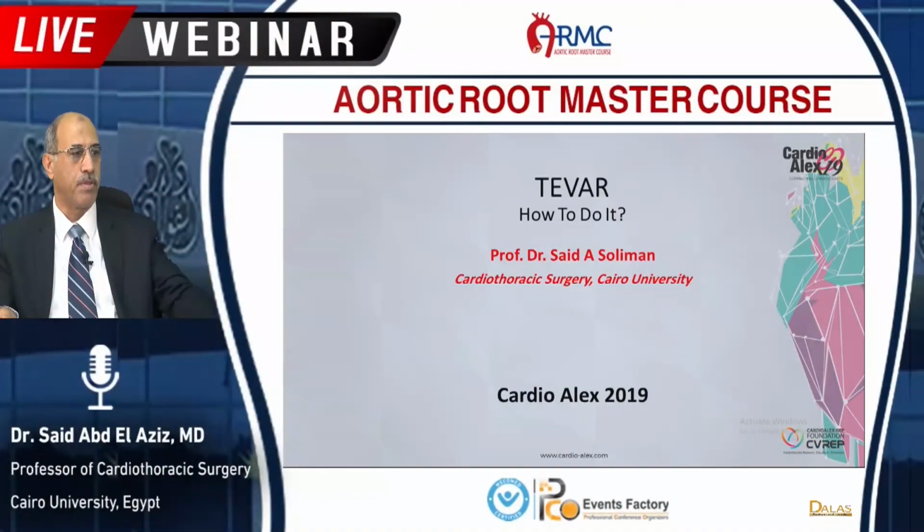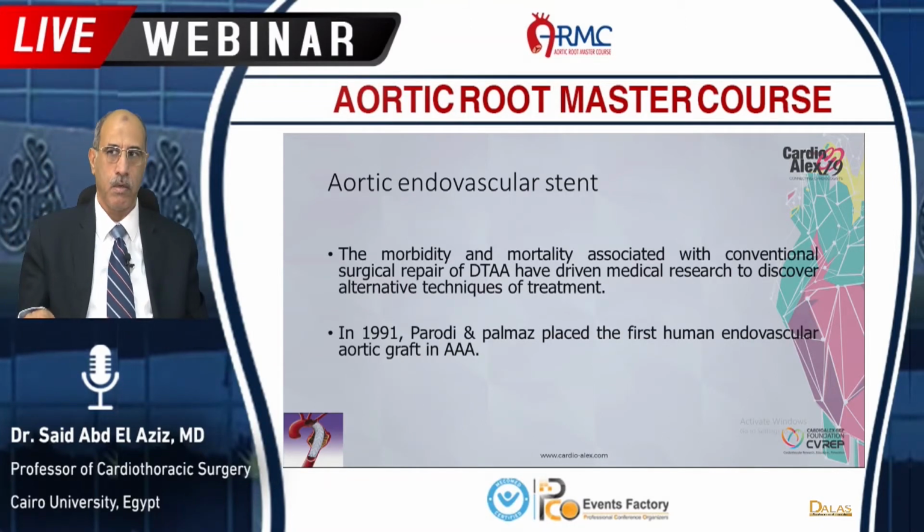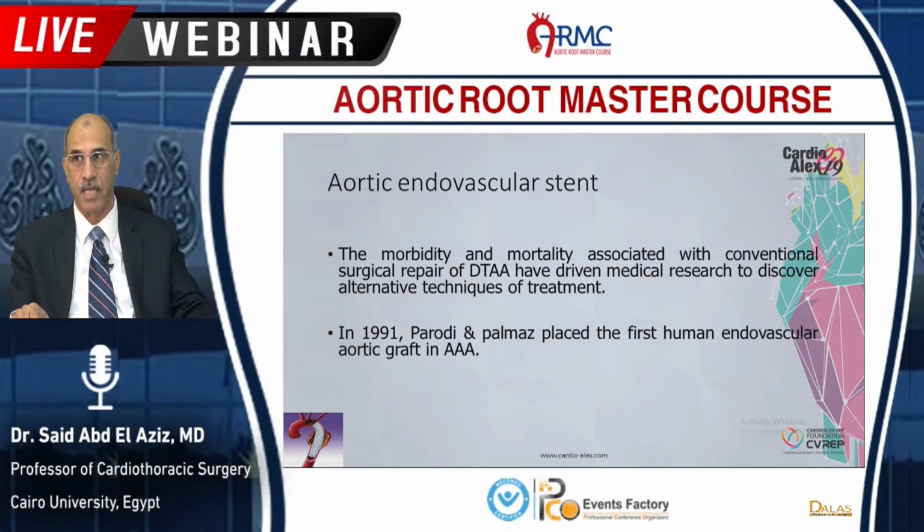Now we will shift to the second presentation, about the TEVAR, how to do it. All of you know that the morbidity and mortality associated with conventional surgical repair of the descending thoracic aorta have driven medical research to discover alternative techniques for treatment.